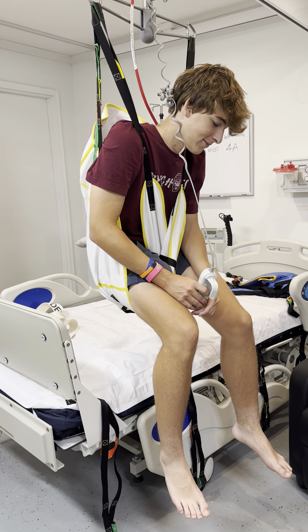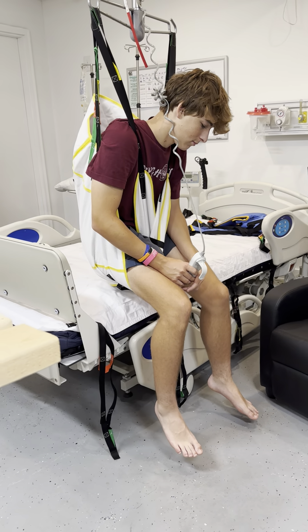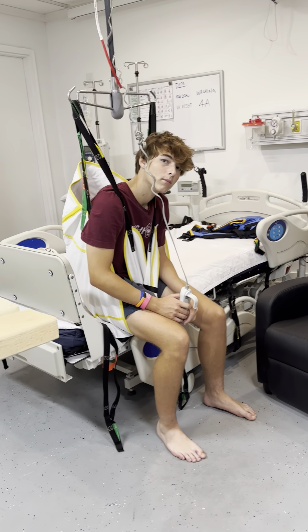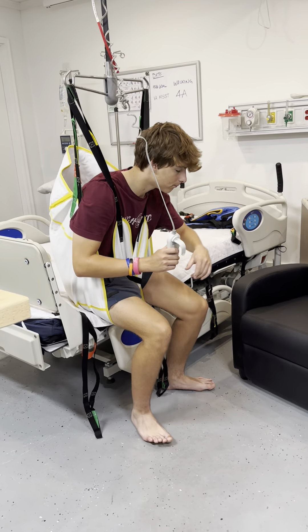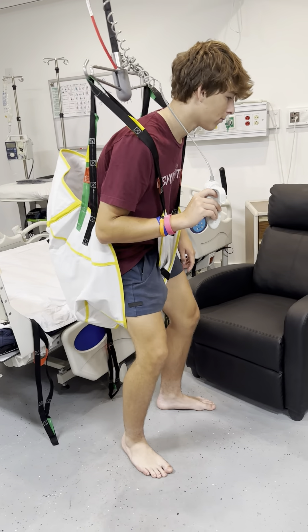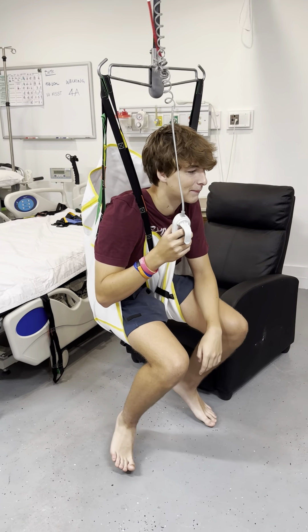The idea is to walk to the chair. And if you fall, do it again.